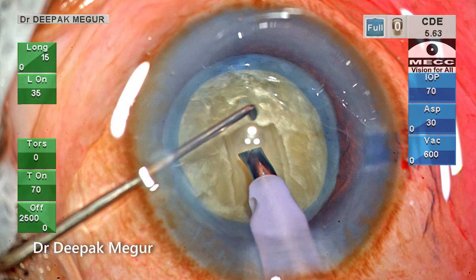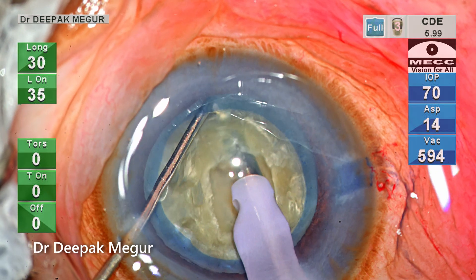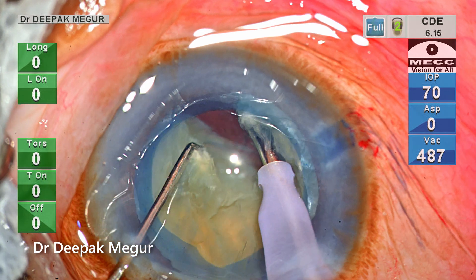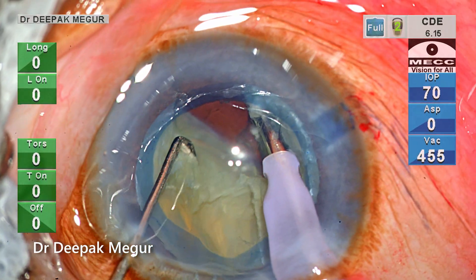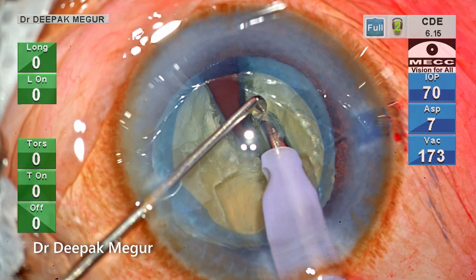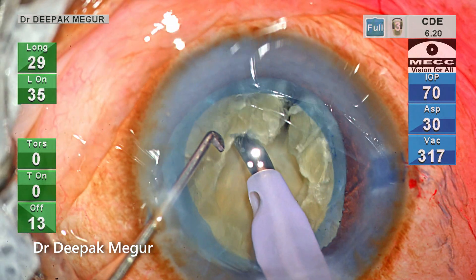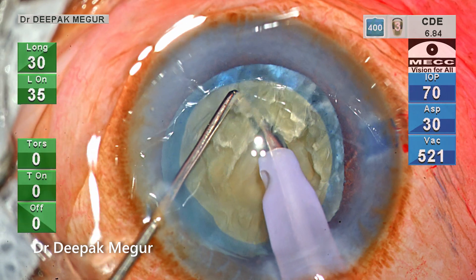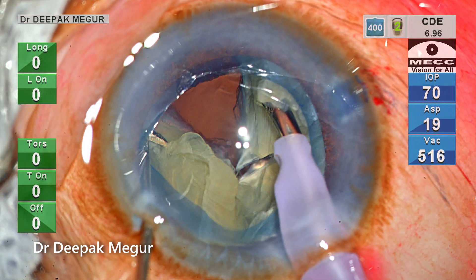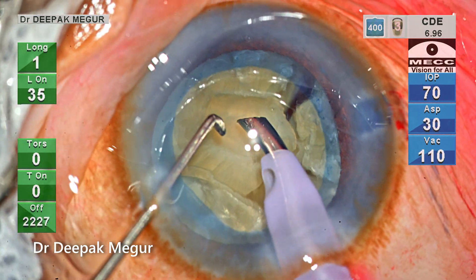The settings are changed to chop mode with only longitudinal energy. The tip is buried into the substance of the nucleus and I'm using the vertical chop technique — the chopper goes down vertically and then lateral separation occurs. I'm aware that the posterior plate cracking has not occurred in the subincisional part of the nucleus, but I don't want to stress it more. I can take care of it as the nucleus is rotated later. The important principle is to not induce a lot of stress while fracturing these lenses.